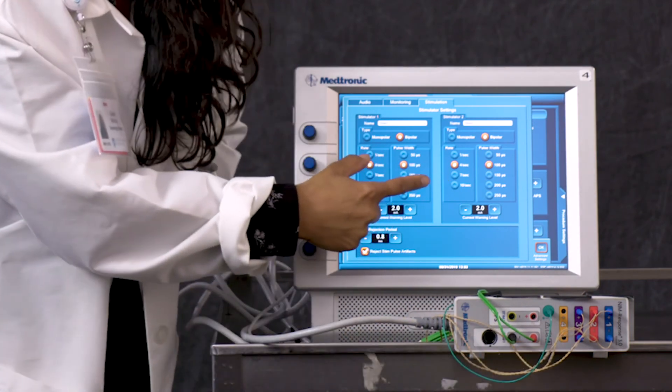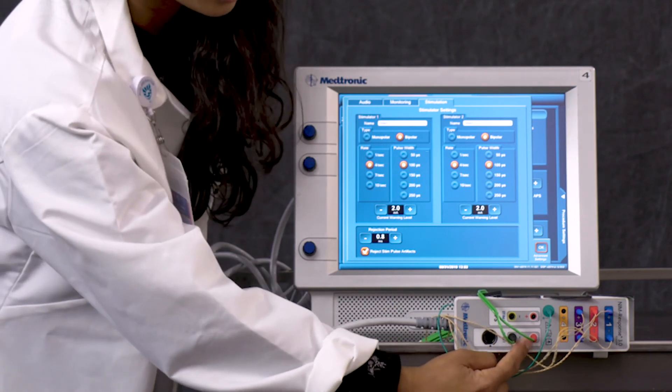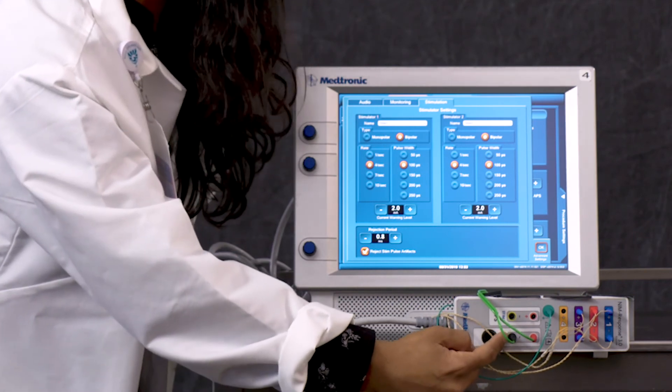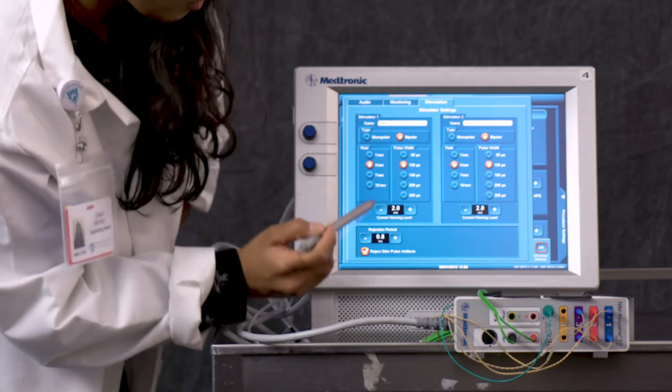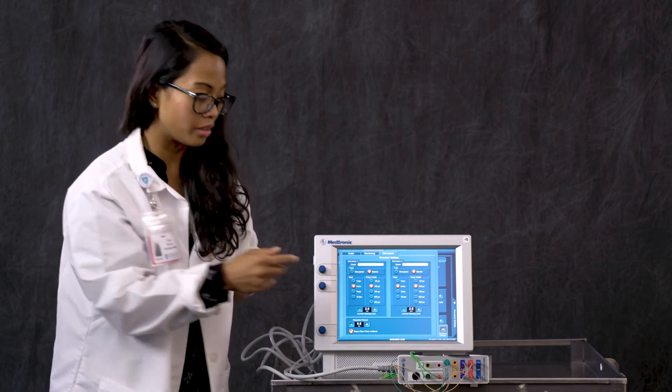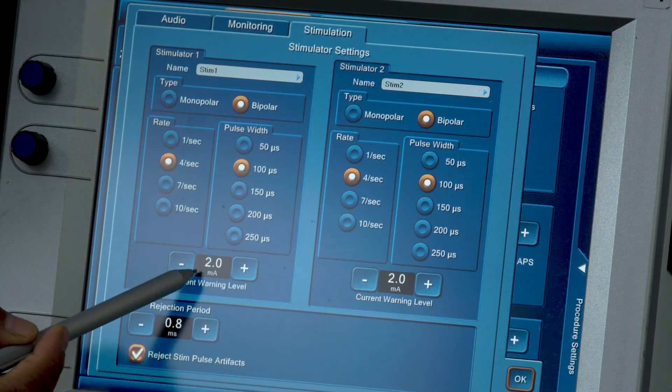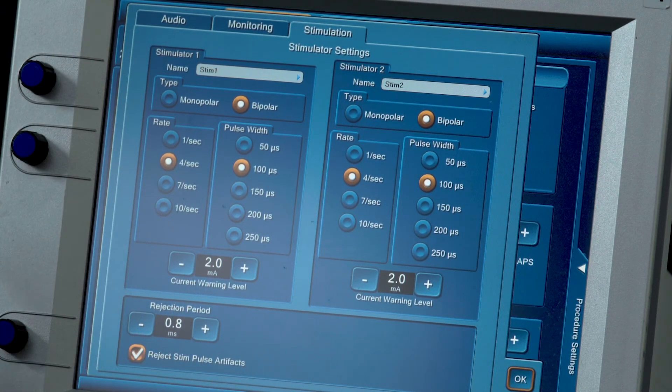For our warning level, what this means is with all the stimulation, there is a cutoff. The warning level, if the stimulator is set too high, it's at two milliamps. You'll get a dialog box. If the surgeon says, increase the stimulation to this, in this case we can't go any higher than 2.0 or two milliamps.